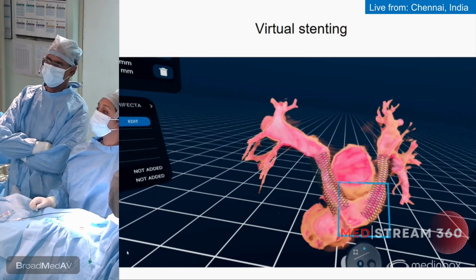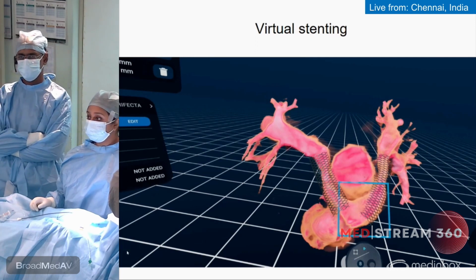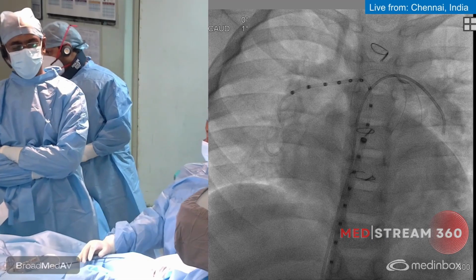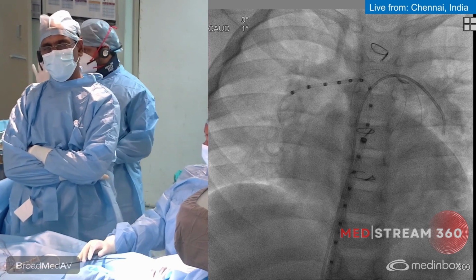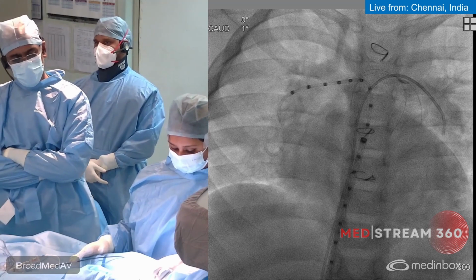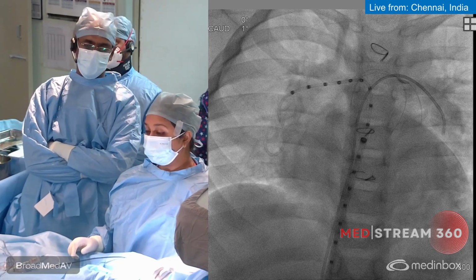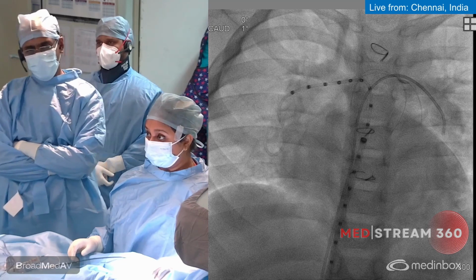And this is one of our patients who is presenting now with branch PA stenosis, who is having increased RV pressures. So we have taken him for an intervention. We did a little bit of preliminary work. We took a right femoral venous, right femoral arterial access, and left femoral venous access. There are two venous accesses that have been taken in order to facilitate bilateral pulmonary artery stenting, so that one sheath will take care of the right and one for the left.